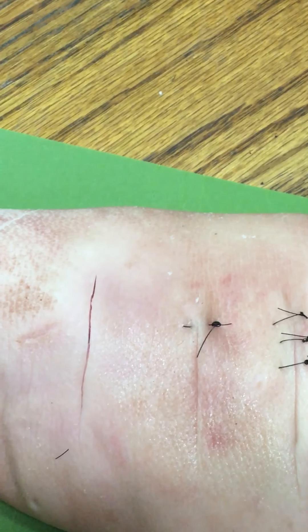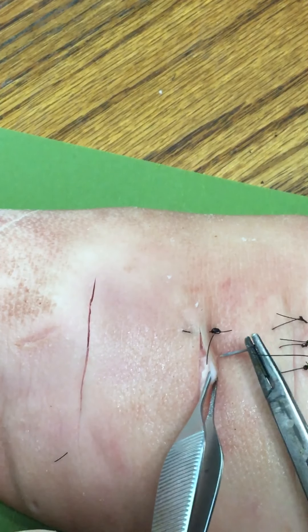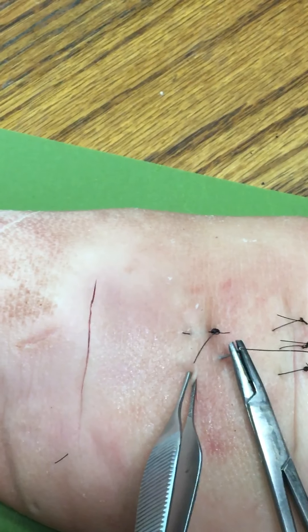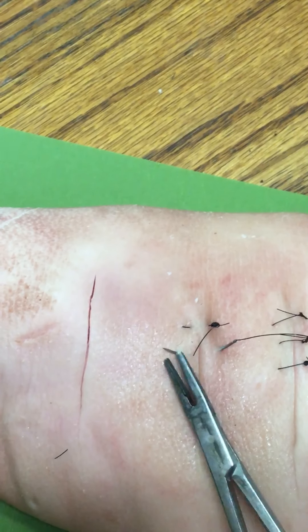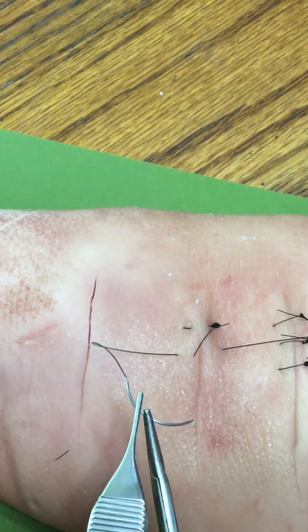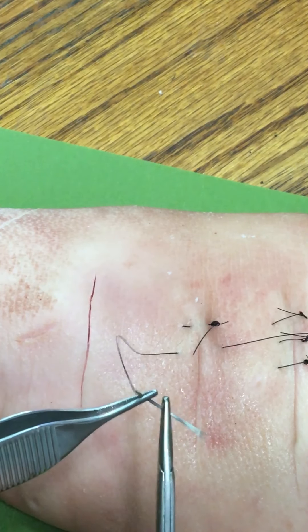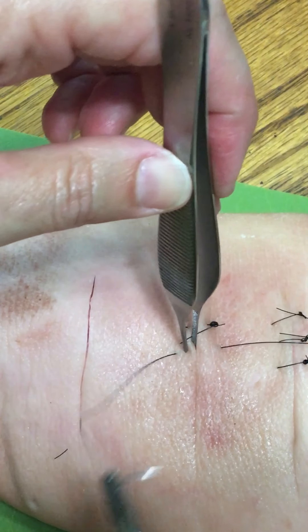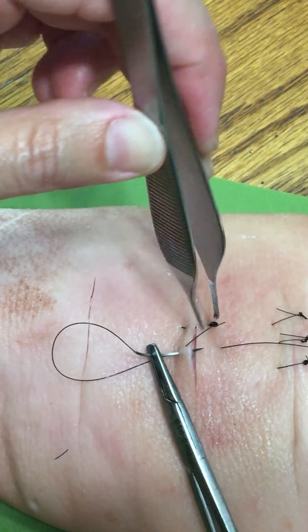Just like the simple interrupted, we want our stitches to be equal distance apart. So deep, come out directly across. Put my needle around and load it backhanded. I'm going to go half that distance and come out shallow, just below the skin.